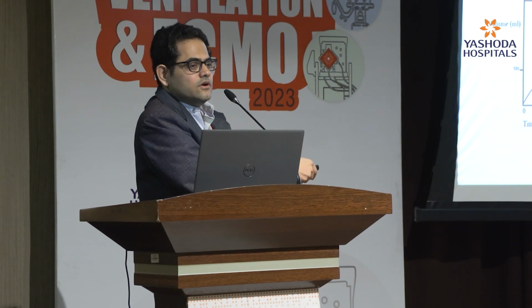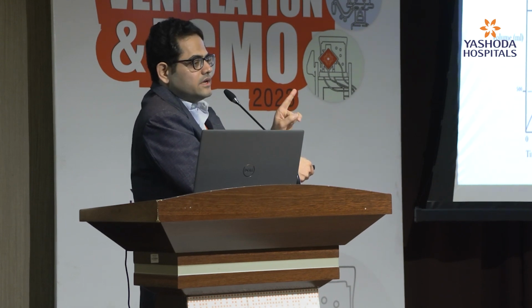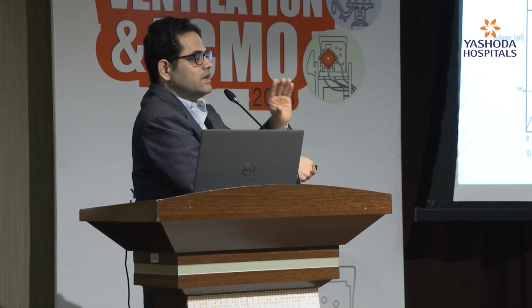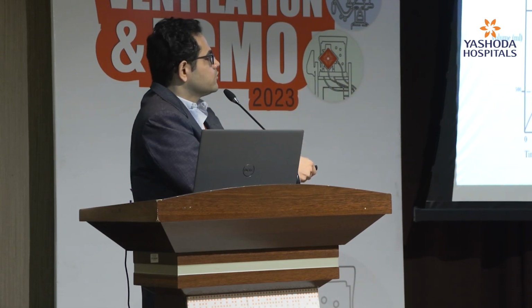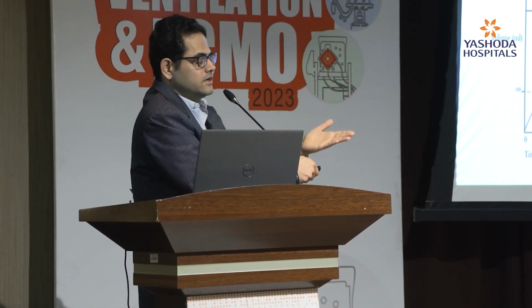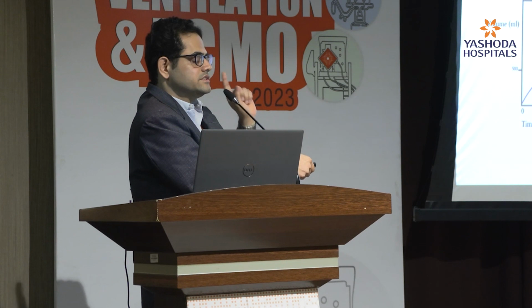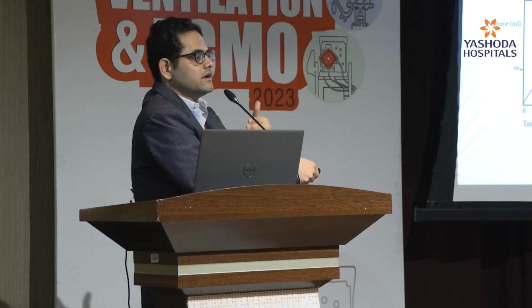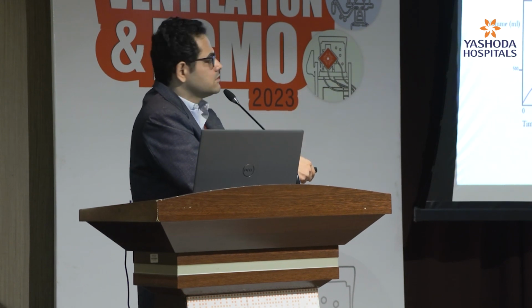Understood? So this is volume control, where in both control ventilations, time is the trigger. Something you are controlling here. Here volume and flow are one and the same. So whenever we are putting a volume control ventilation, automatically flow will also be controlled. So it is flow limited, and whenever the volume is delivered, the ventilator goes from inspiration to expiration. That is what is volume cycling. So in pressure targeted or pressure control ventilation, again control ventilation, time is the trigger, pressure will be limited, and time cycled. After that particular period of time, the ventilator goes from inspiration to expiration.